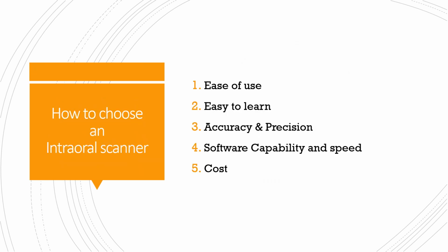So how do you choose an intraoral scanner? Well, you want to make sure that it's easy to use. You want to make sure that it's easy to learn how to use it, and that the accuracy and precision of those digital impressions are good, because we want to make sure that the appliances actually fit, right? We want to make sure that the software capability and speed is up to par.